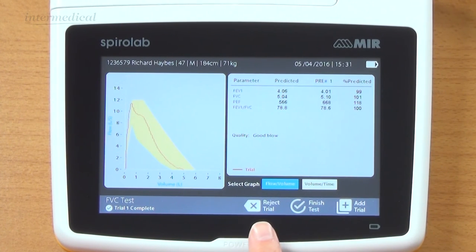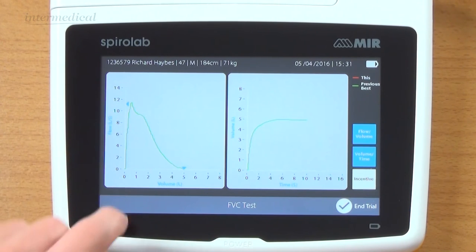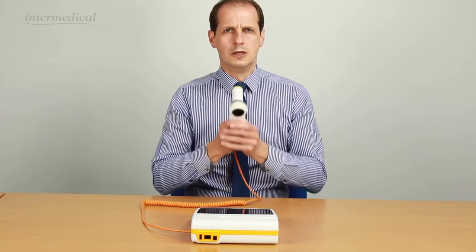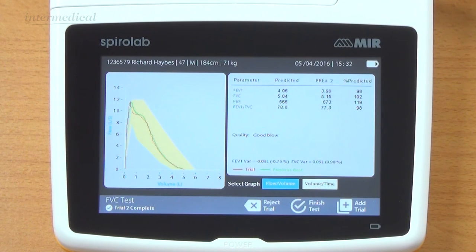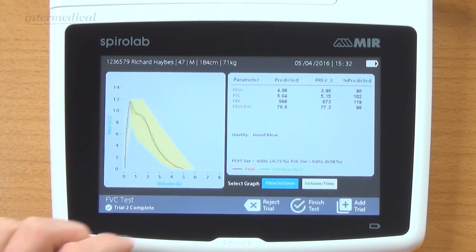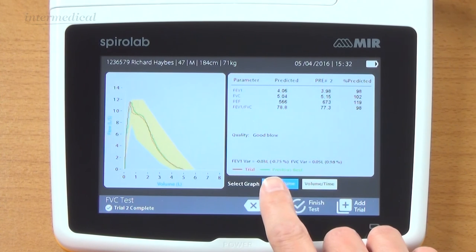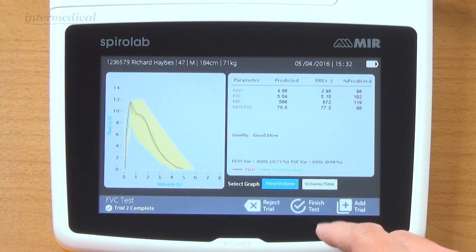I'm going to click on add trial. The option is there to reject it or finish test. There's my current one. The blue arrows indicate where I previously got to for volume and peak flow. We've now got two graphs overlaid - pretty reproducible, both within the predicted area. Variation is shown here: 0.98% for FVC and 0.75 for FEV1. And compared to predicted it shows us here. I'm going to go on and do a third one.